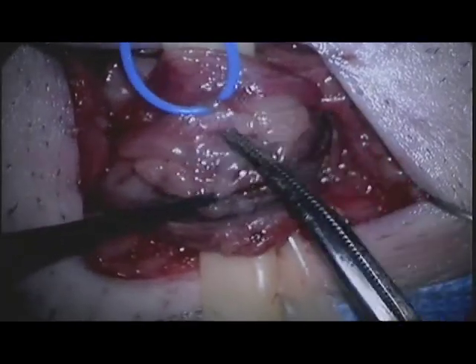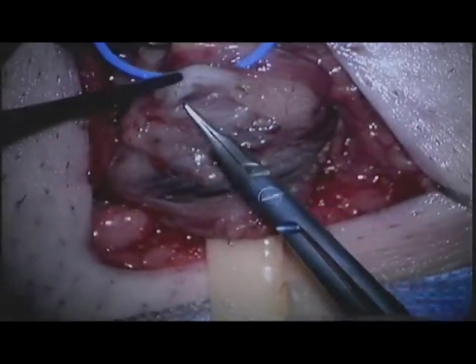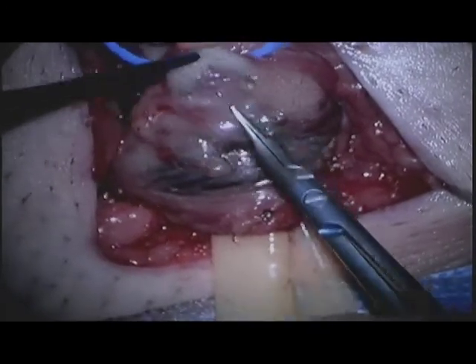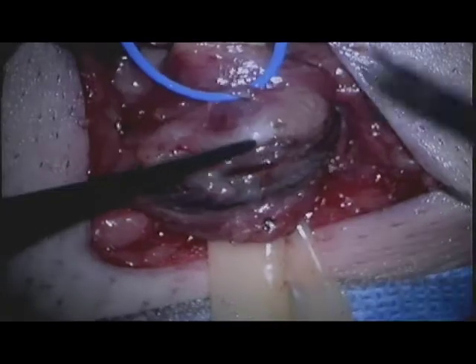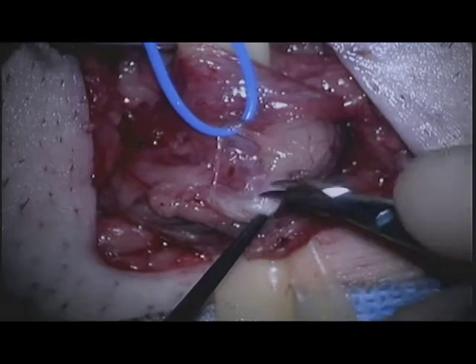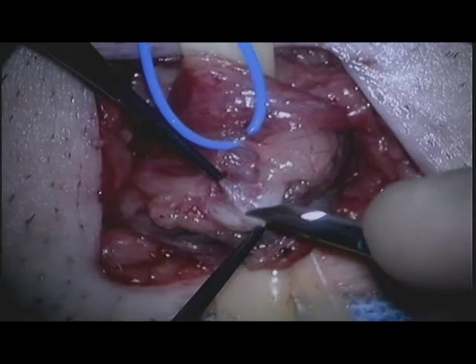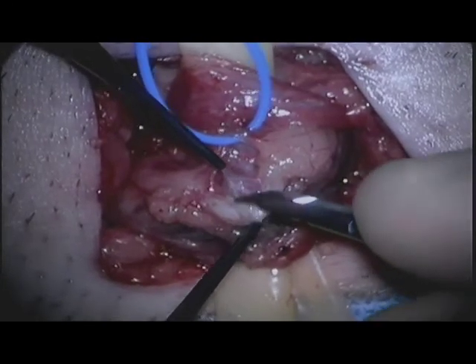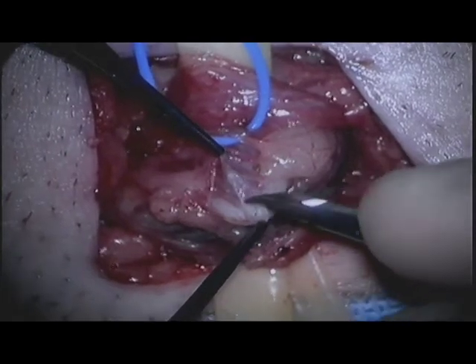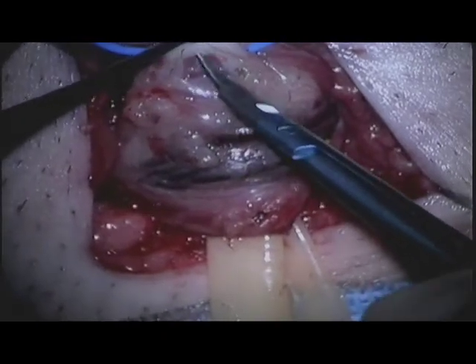The vas deferens has now been identified. It is grasped and delivered, allowing for easy dissection off the surrounding vasal package structures. In patients for whom fertility is not a concern, transection of the vas deferens is recommended, as this carries a large number of nervous tissue fibers.